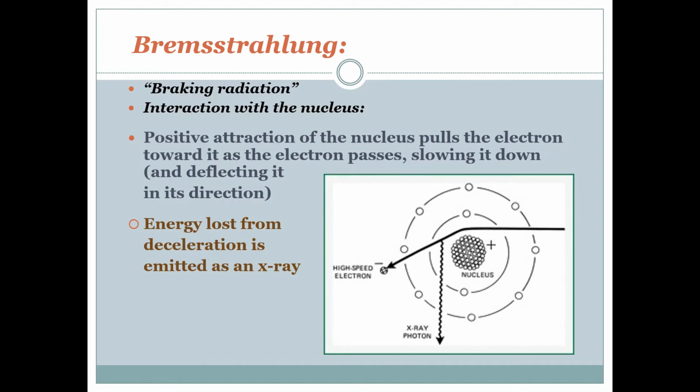So in this image, we're showing an X-ray photon created, but remember, go back to the preface, more than 99% of the interactions that happen at the target, this is the target we're talking about, don't create X-ray photons. Most of them create infrared and visible light radiation.